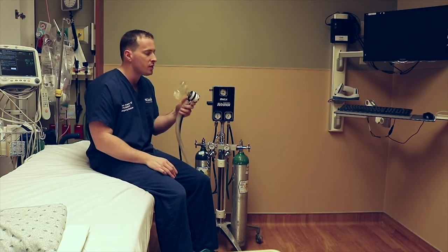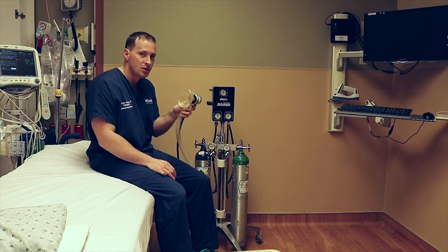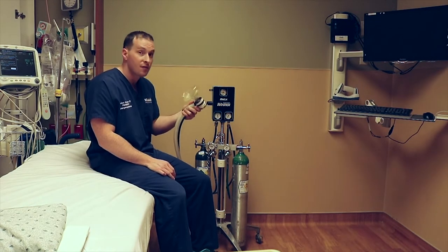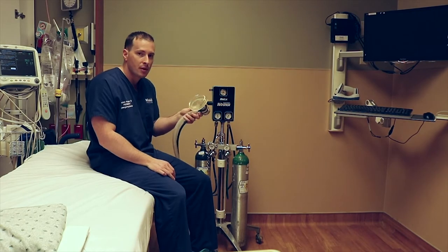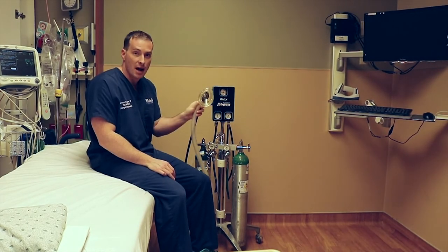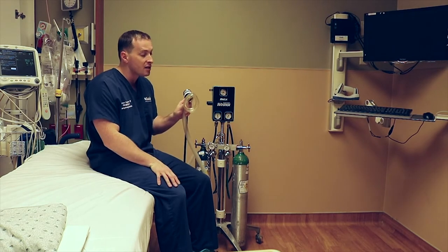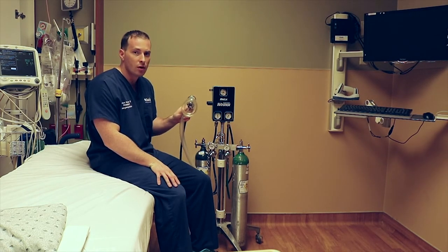Little kids that are a little bit too rambunctious or scared are not going to be able to hold this up to their face. The patient themselves has to hold the mask up to their face, because it acts as a safety mechanism — if they pass out, they drop the demand valve mask and they're no longer getting nitrous oxide.